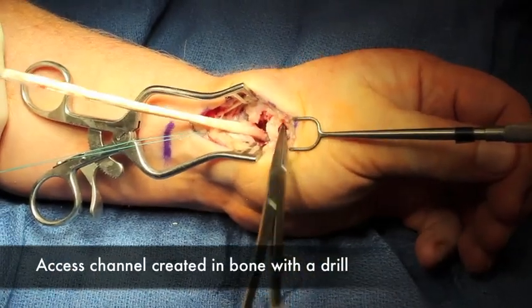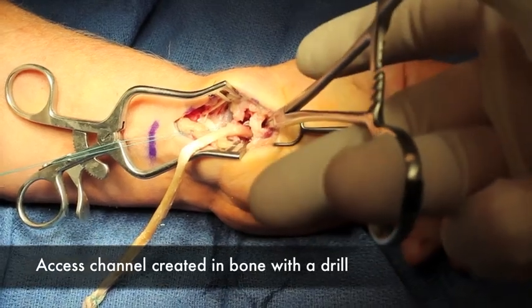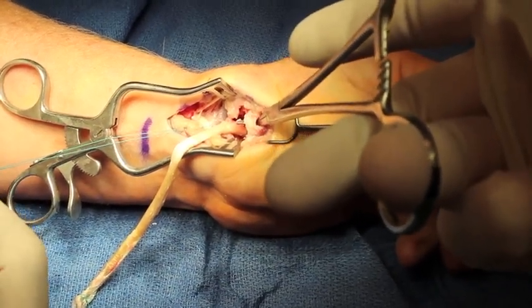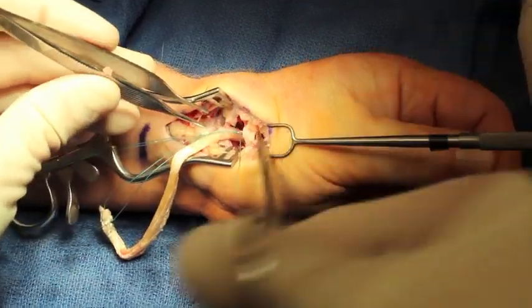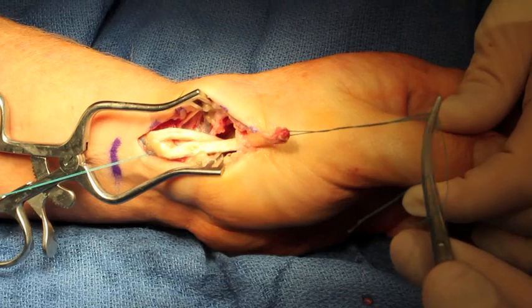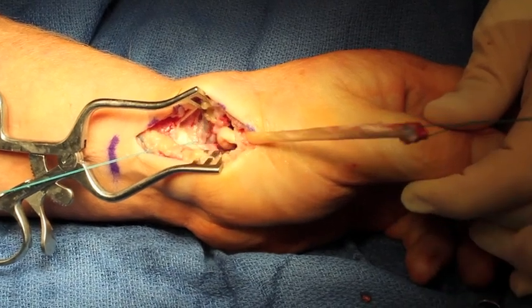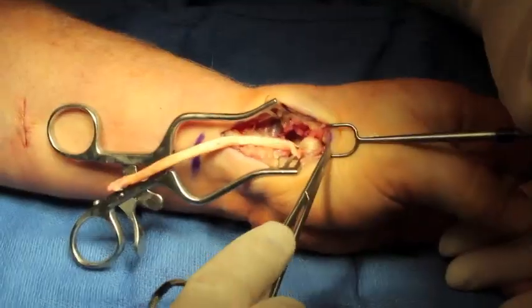A channel has been drilled through the thumb metacarpal and now the FCR donor graft is placed through the channel, and it will be sewn back onto itself suspending the thumb metacarpal, and it's sewn in in this position.